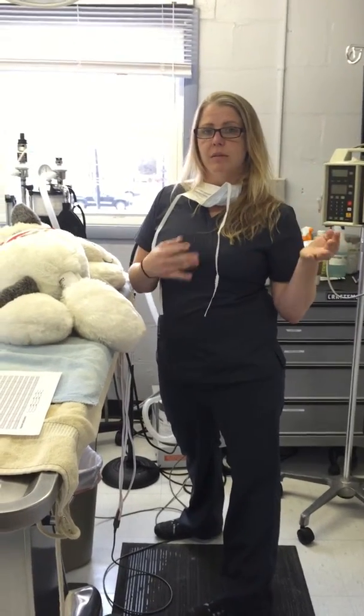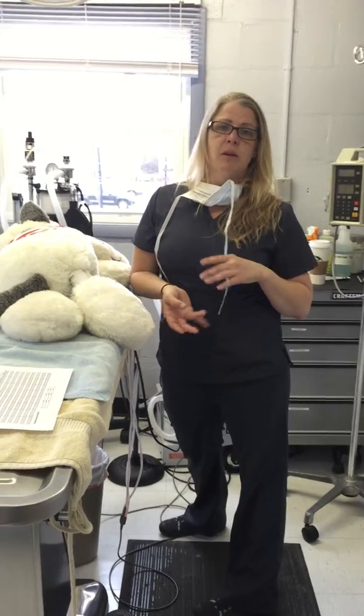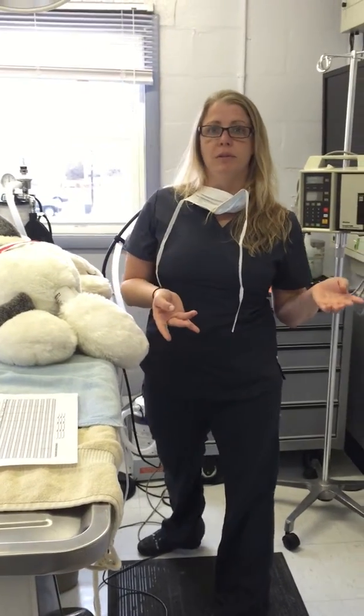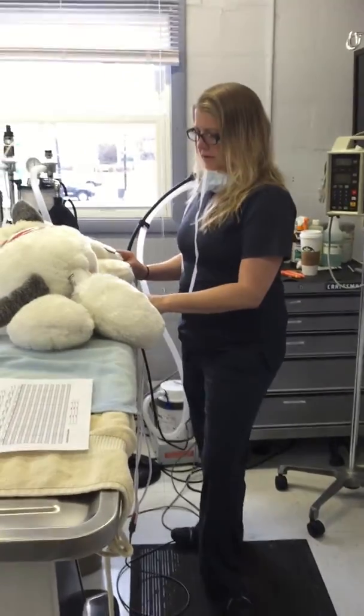And if their respiratory rate is a little erratic, where it's not nice and steady, that could show that they're either having pain responses, they're too light, they're just not comfortable, they're not in a good plane of anesthesia. So that's the first thing that these monitoring devices are for.